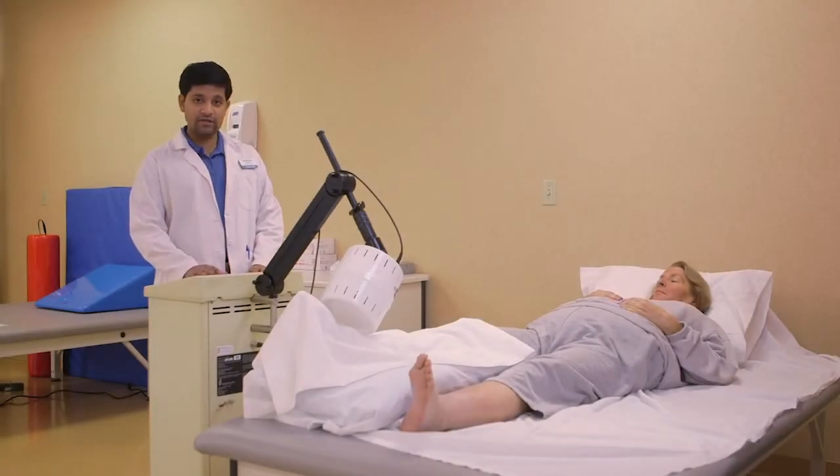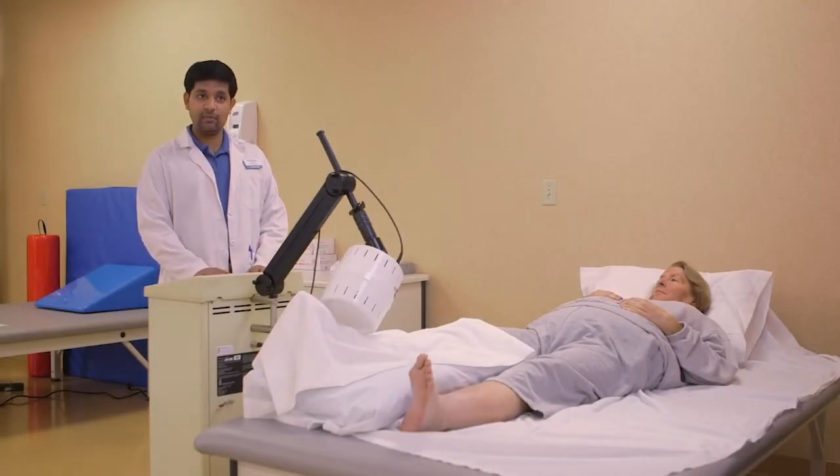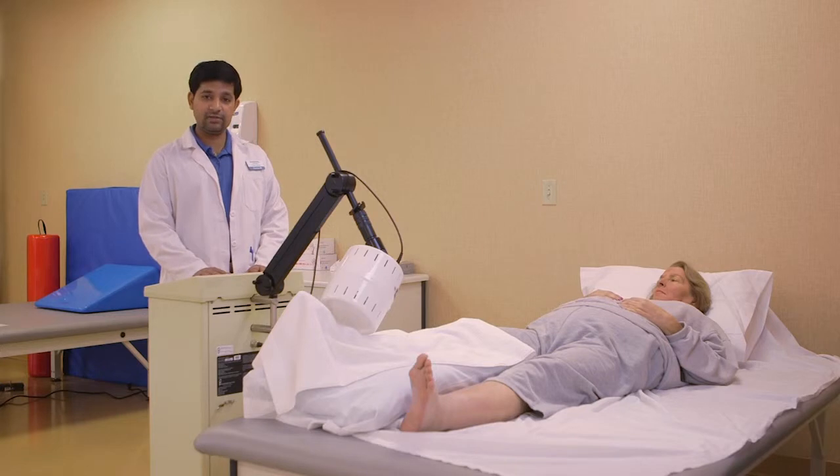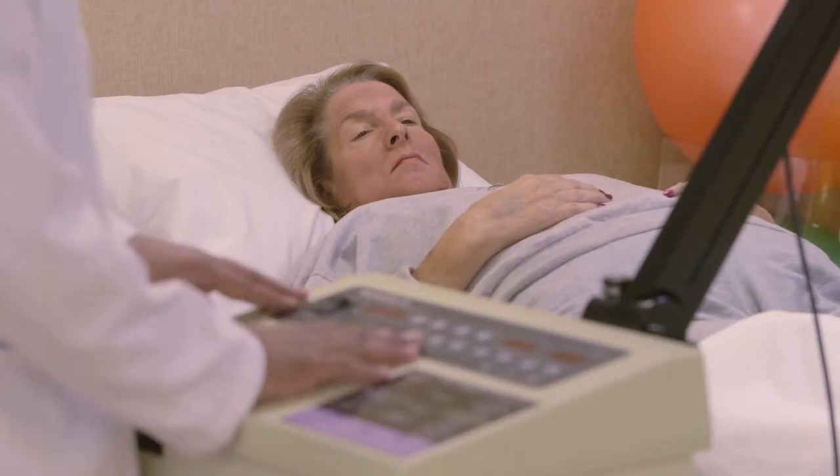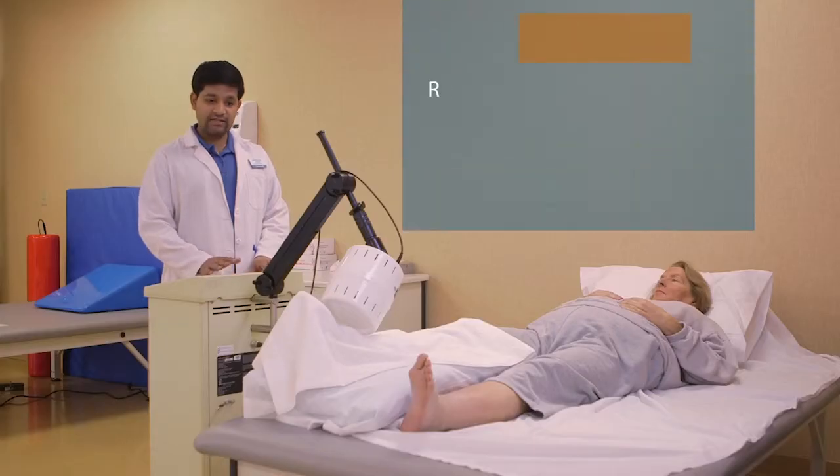The equipment we have here is a short wave diathermy. It's a deep heating modality. It helps in increasing the blood circulation by increasing the body temperature of the body part, and we use it for chronic pains, acute pains, as well as in edema management.